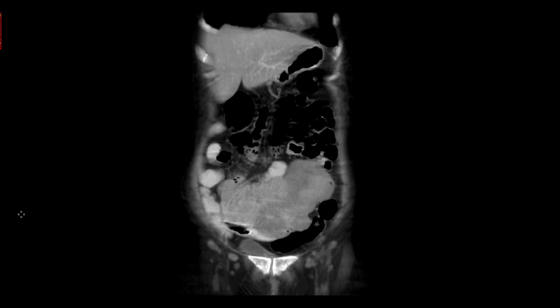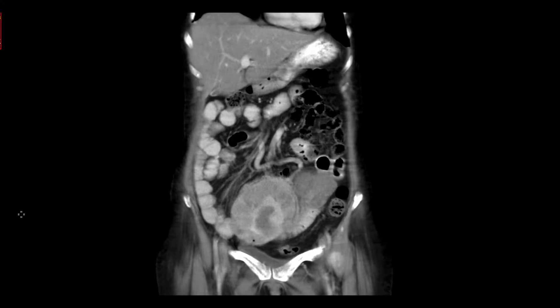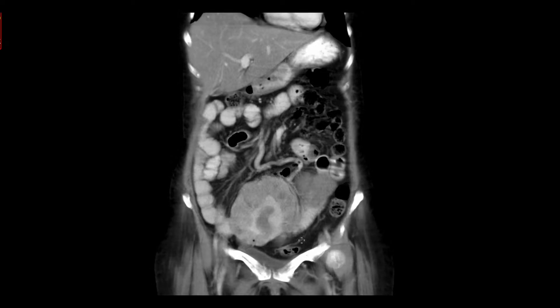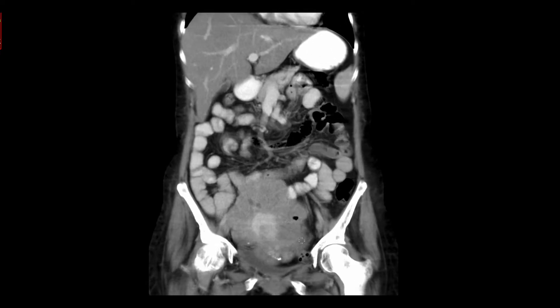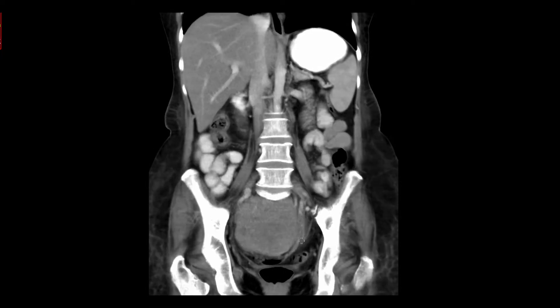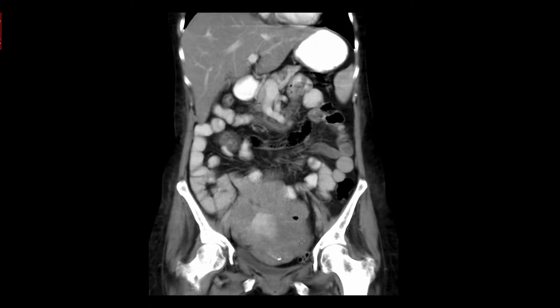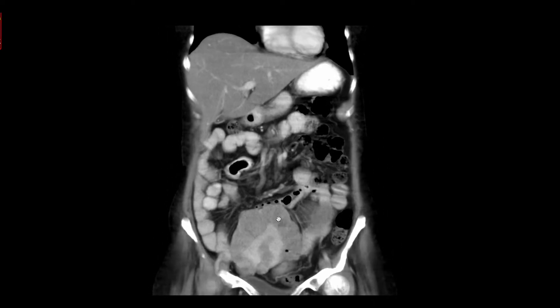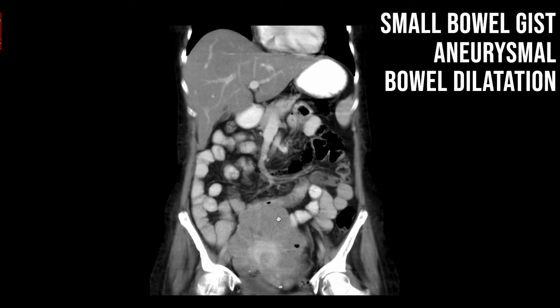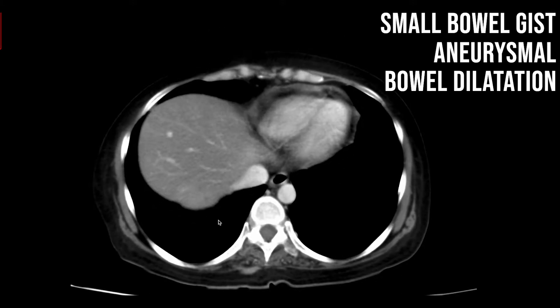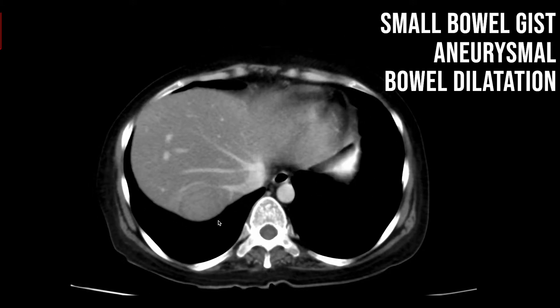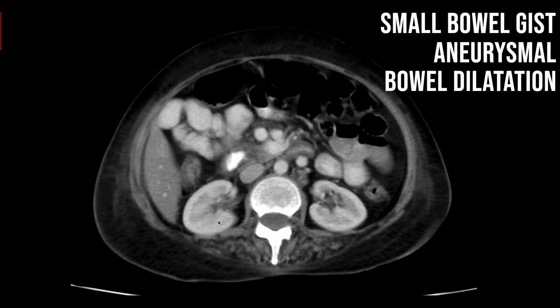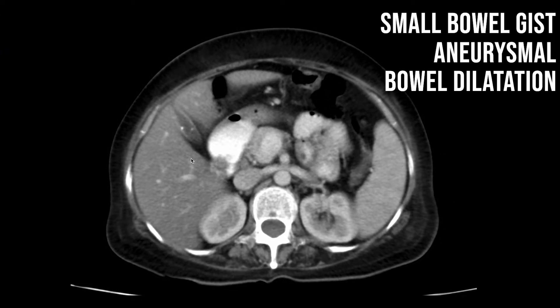An elderly male patient presented with lower abdominal pain. You can appreciate a thickened bowel loop with an irregular contour in the lower abdomen extending into the pelvis, with mesenteric fat stranding. You can also appreciate a lesion in segment seven of the liver. This is an unusually dilated small bowel loop in a case of gastrointestinal stromal tumor. You can also appreciate metastasis, and on axial sections, GB concretions are noted in this case.